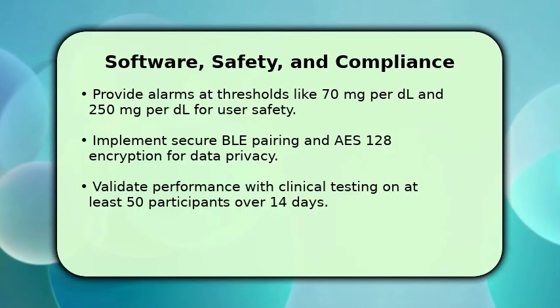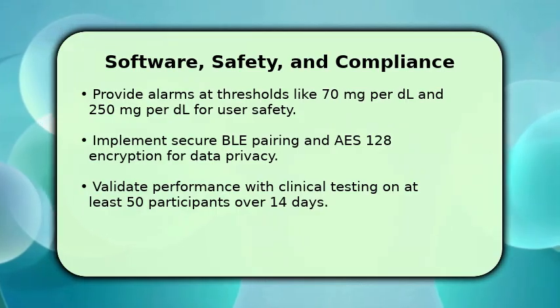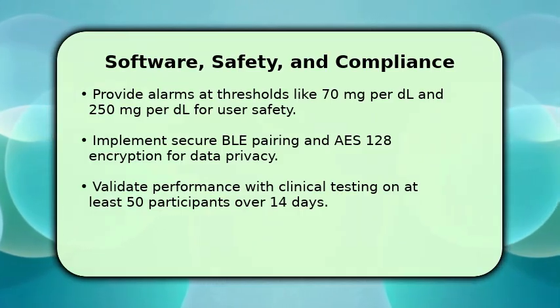Follow medical device standards and document risk management, software lifecycle, and cybersecurity controls. Validate performance with clinical testing on at least 50 participants over 14 days.